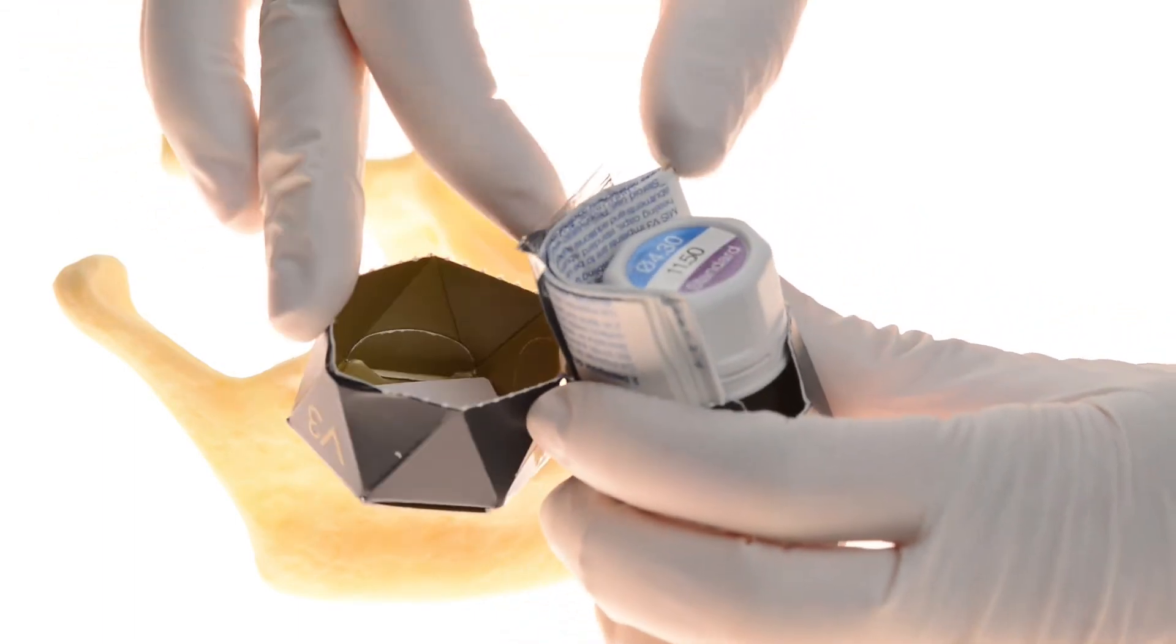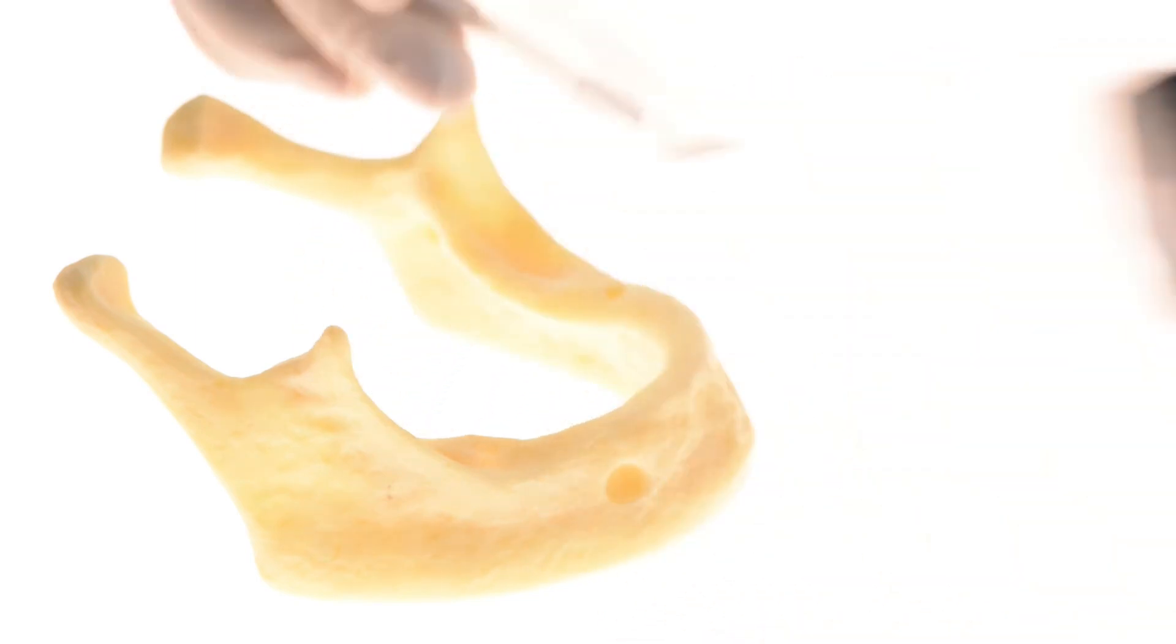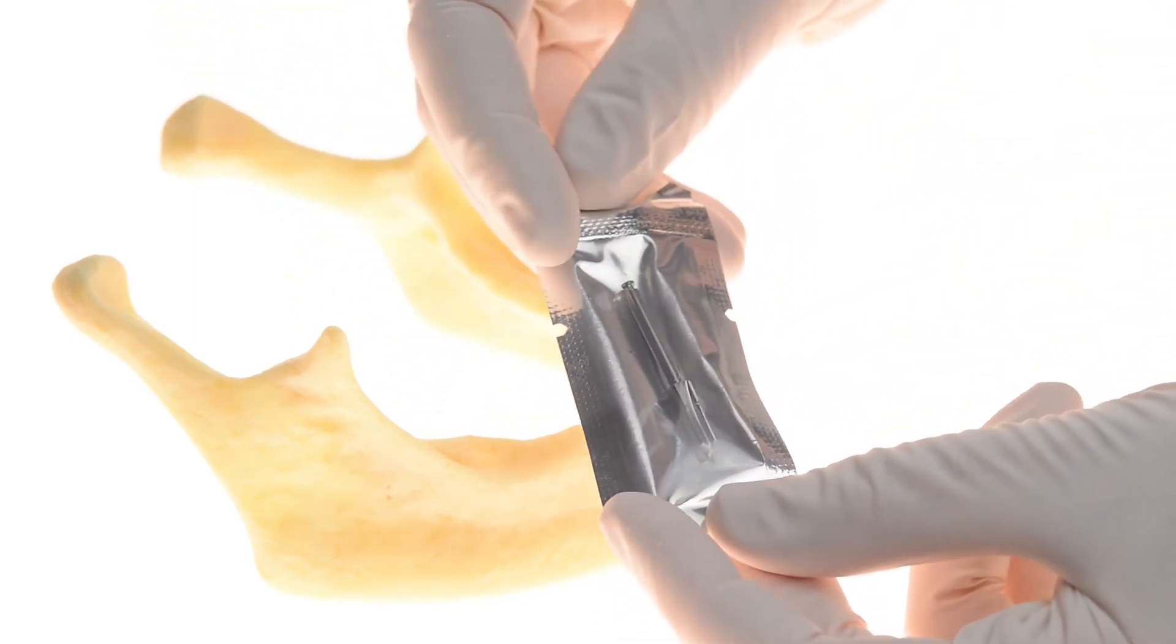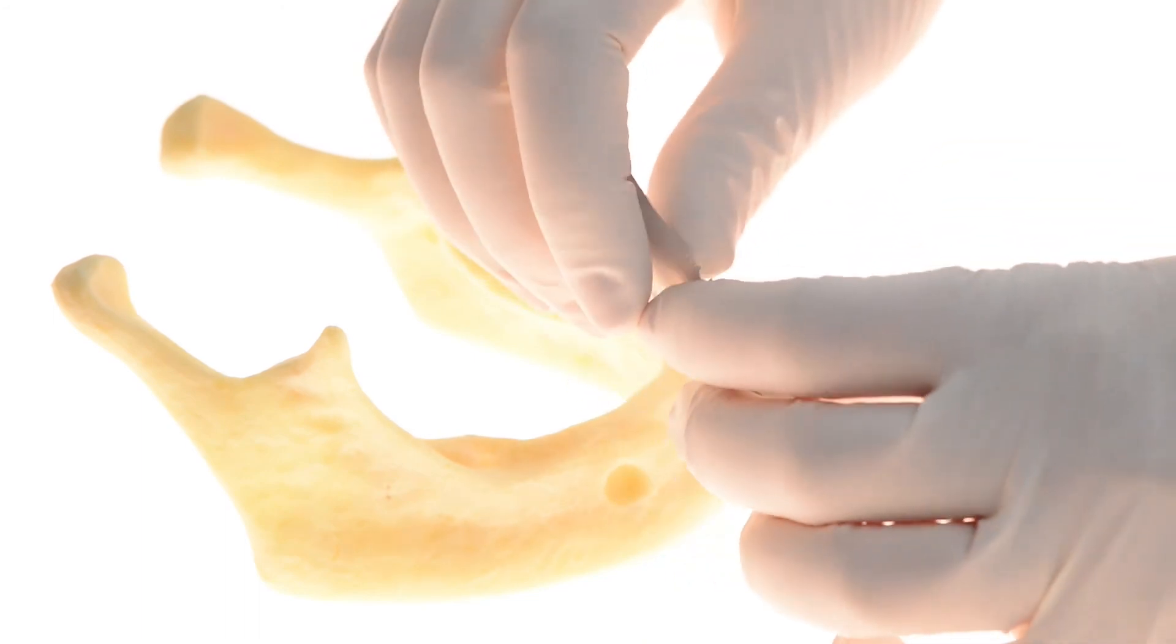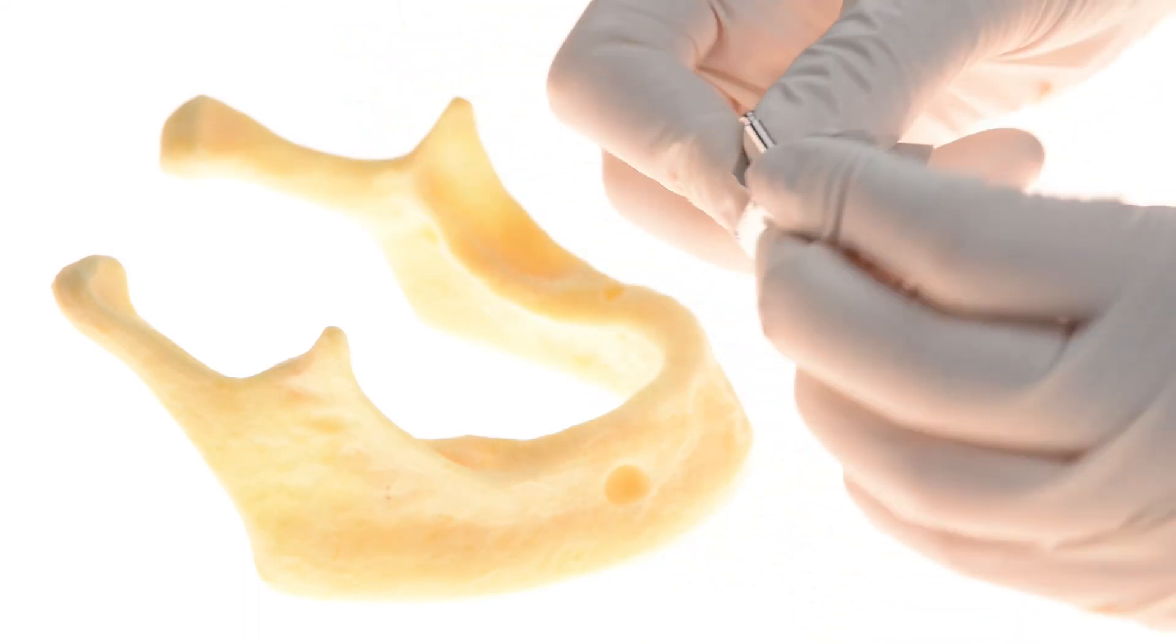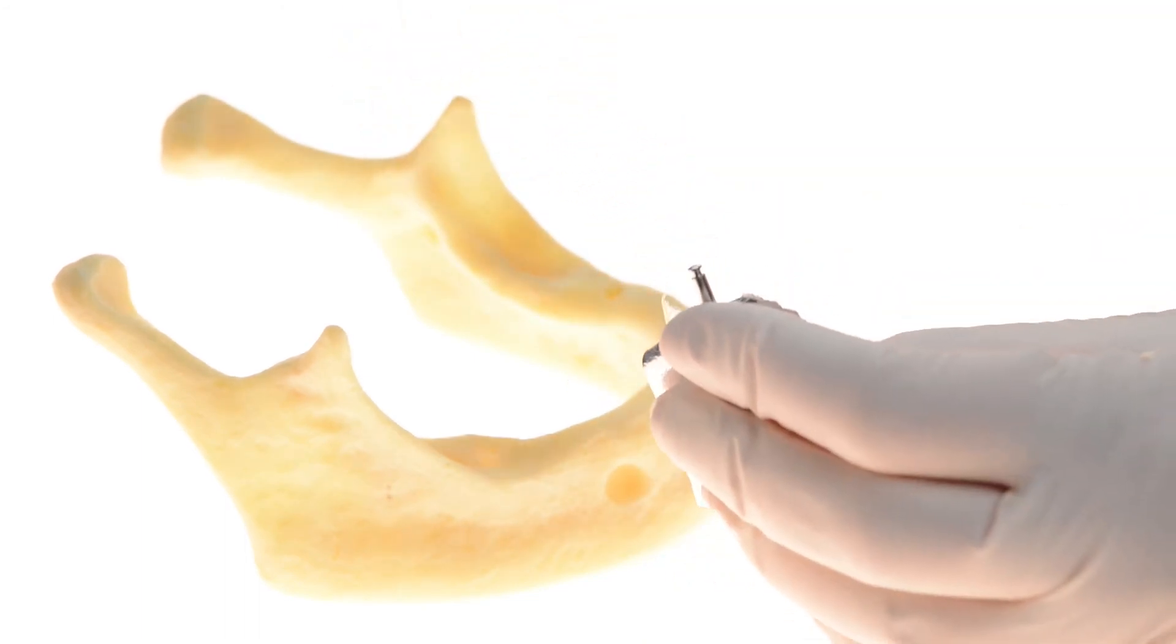At this point, we are ready for the sterile, single-use final drill, which is perfectly compatible with the implant we've chosen to place. Each V3 implant comes with a single-use final drill and a sterile cover screw.